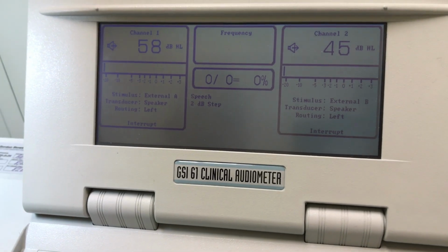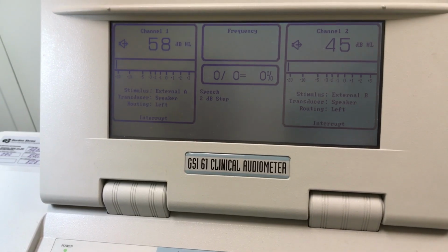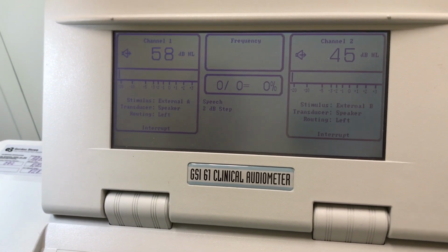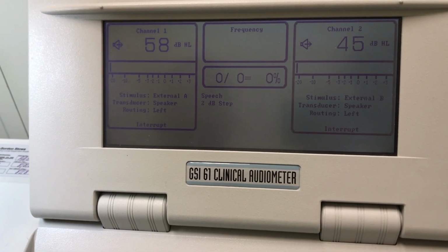We calculate the ANL as the MCL minus the BNL. In this case, in our example, MCL of 58 and BNL of 45, our ANL is 13 dB.